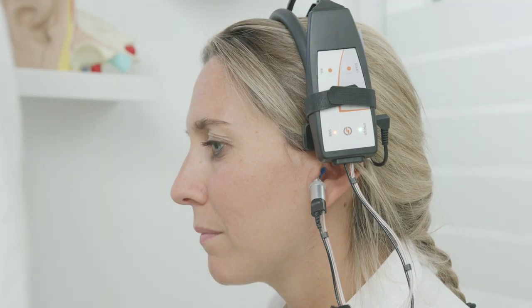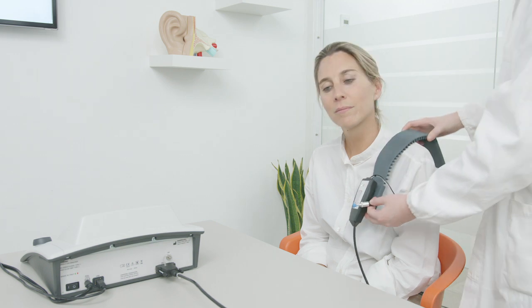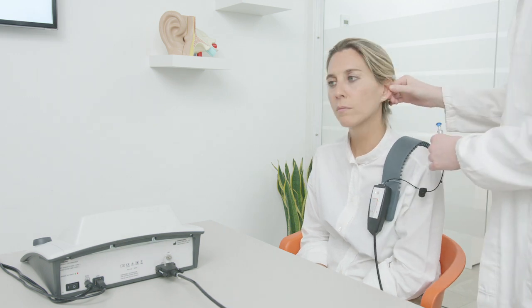The probe can be mounted on the headset of the contralateral headphones using the clips on the headband, or if you opt for an insert earphone for contralateral testing, it can be mounted on the shoulder strap.